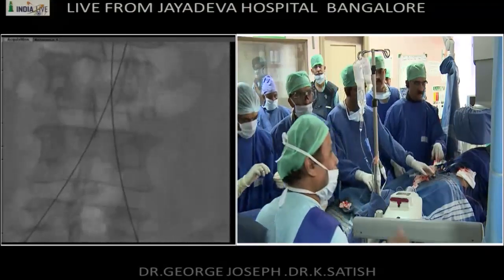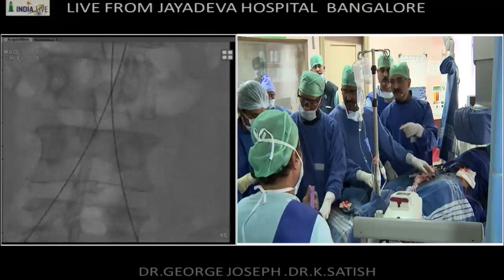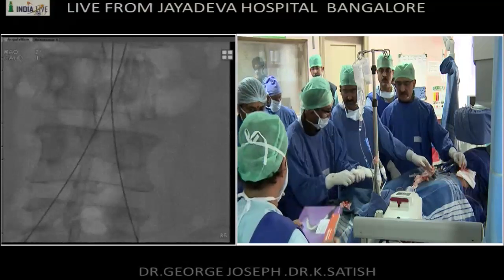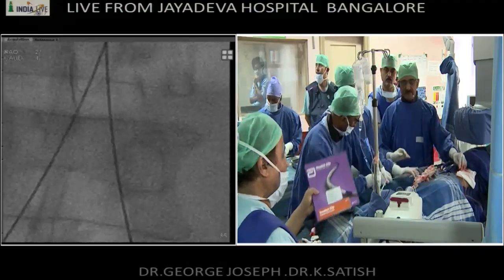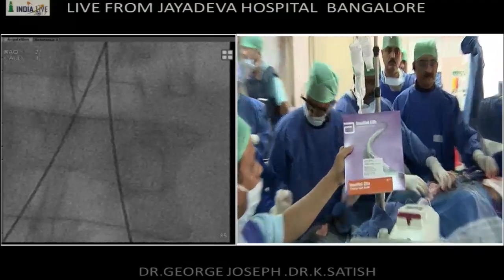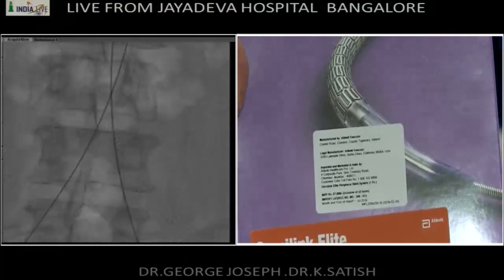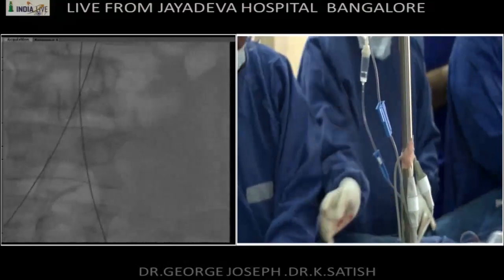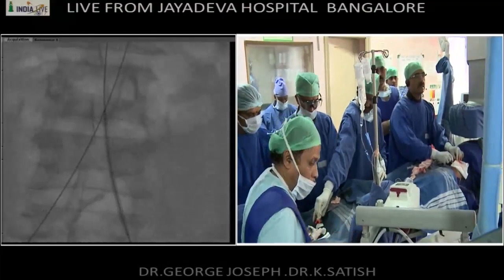Okay, so now we're going to stent. I'm choosing 8 mm diameter, 59 mm length stents on both sides. It's OmniLink Elite. Both inflation devices.